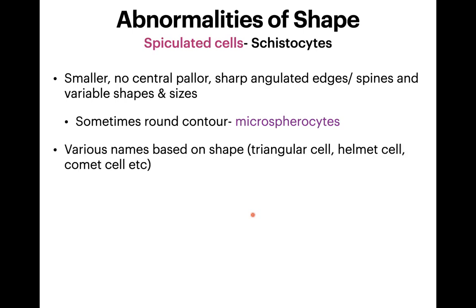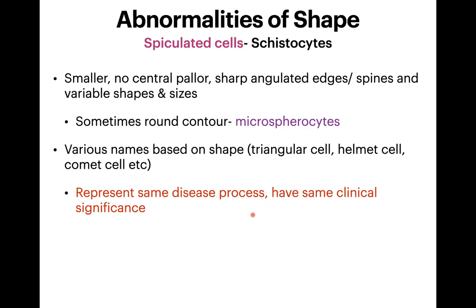Various names have been given to these shapes — triangular cell, helmet cell, comet cell — but there is no need to describe them as separate kinds of cells. Just call them schistocytes, because they represent the same clinical process and have the same clinical significance. Describing them separately only increases the length of your peripheral blood film report and may confuse the clinician.